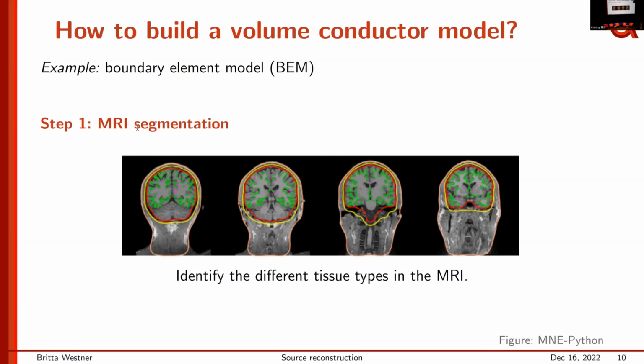Okay, thank you for your talk. I was wondering about your beamforming and this covariance matrix. When you actually have bad channels and then put it in with the neighboring ones, I was wondering whether this could result in a problem for your covariance matrix. And this leads to a more general question: it looks like beamforming doesn't like ICA, it really likes raw data with noise.